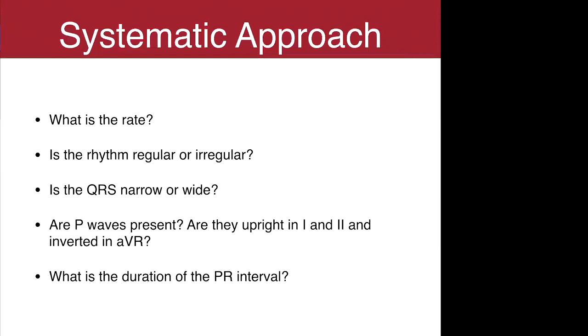Good. So when it comes to calculating the rate in the real world, when you get into clinicals and into practice, the computer is going to be reliable 99% of the time. The methods we're teaching here are just ways you can manually calculate it in case things don't go well with the computer.